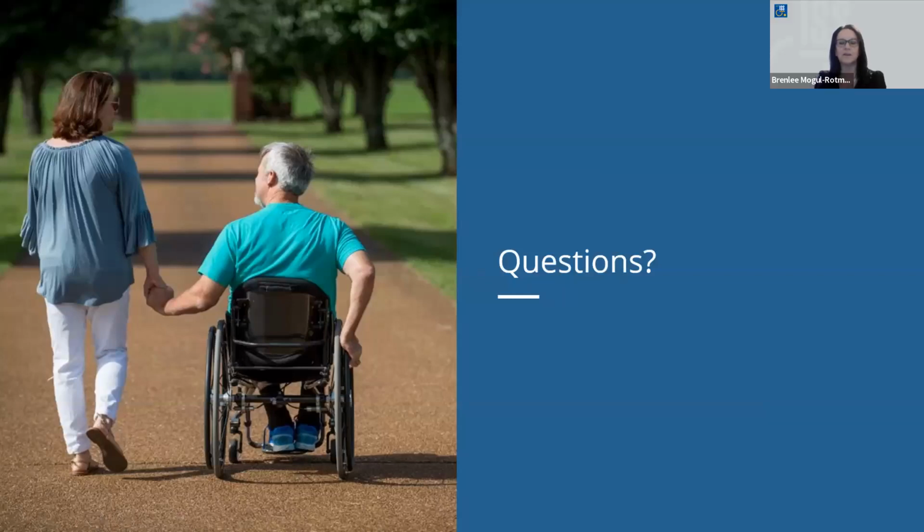I agree, Tamara had just commented to be sure with scoliosis to look at what's happening outside of the wheelchair and look at that 24-hour positioning. Totally agree. We need to look at how the client is being moved. What other places are they sitting in? And then certainly during sleep, are they only lying on one side or do they turn to the other side? Do they have any positioning components? So absolutely, thank you for that comment.